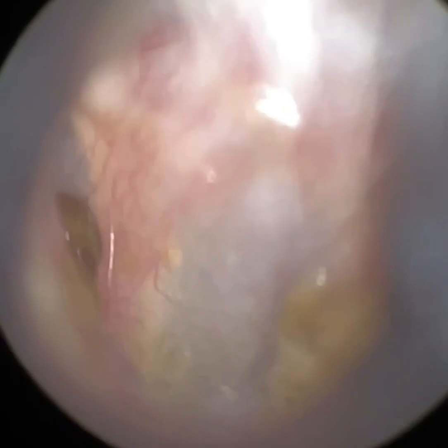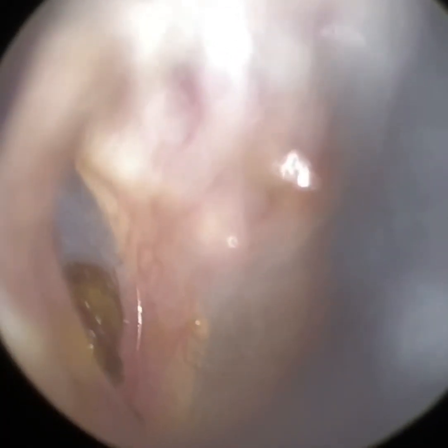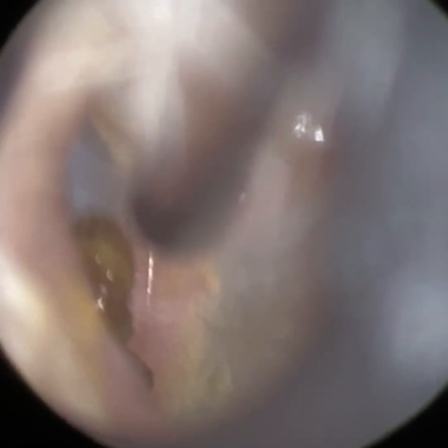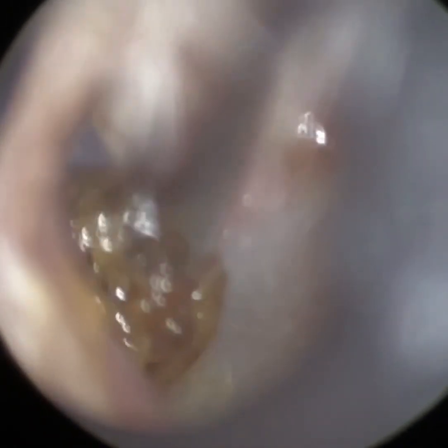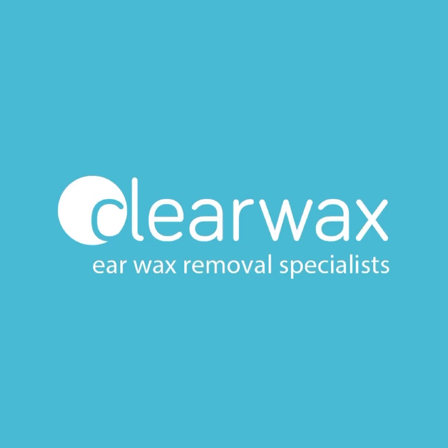Now, they have got a super bendy ear canal, so I'm just using the speculum to straighten the canal as much as I can. We're just now going to insert a fine-end suction probe and slowly but surely go towards this wax, which is in focus. You can just see how prominent that anterior recess was — we removed that large piece of wax.